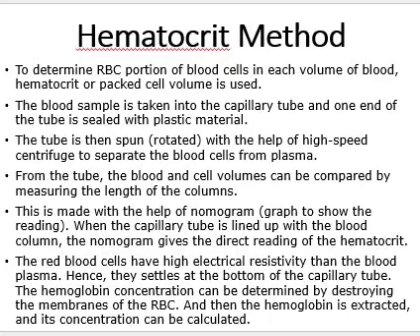What is that length of column? It is very simple. There is a measuring stand. After the rotation is completed, that sealed capillary tube is placed in the marked stand.